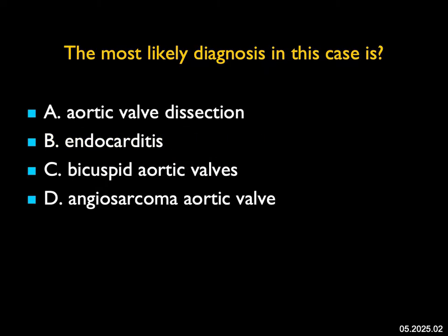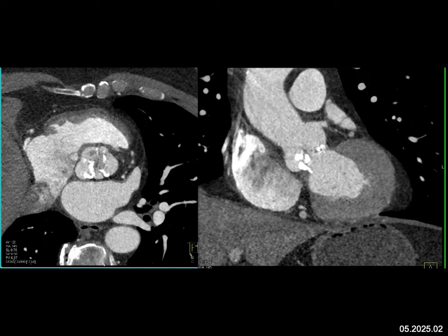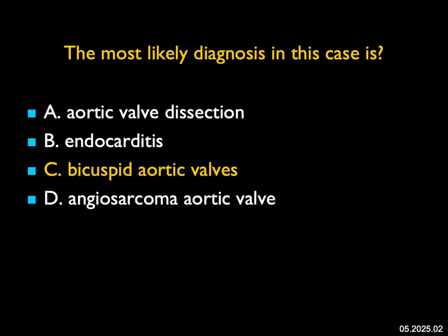The most likely diagnosis in this case: we're looking at the aortic root and the aortic valve. There's thickening and dense calcification. When you look at the shape of the valve, we don't see a dissection present in the valve or the ascending aorta. There's not a sarcoma — you can get angiosarcomas typically of the right ventricle. Endocarditis is more of a clinical diagnosis; we don't see a thickened valve with polypoid lesions or thrombi. What we see is a thickened valve with lots of calcification and an abnormal shape. This is the classic appearance of a bicuspid aortic valve with extensive calcification. The patient will need a TAVR procedure — aortic valve replacement. Bicuspid valves fail earlier and calcify earlier than classic tricuspid valves because of the turbulent flow.